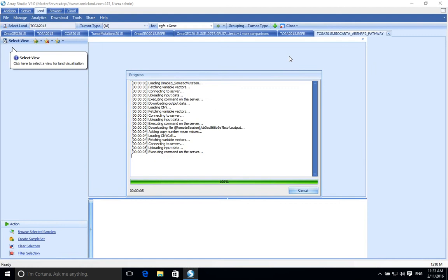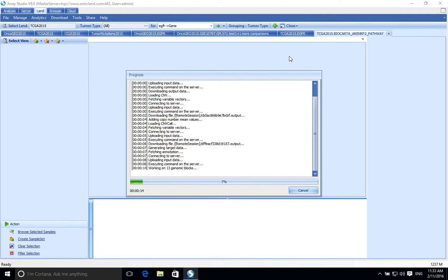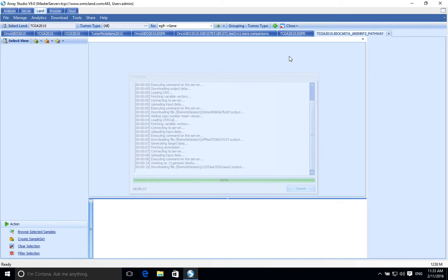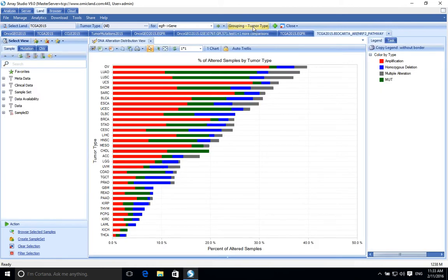And in the paper, they said that they saw more mutations in this pathway in the type 2 classified samples than they did the type 1. So we're just going to check to see if that's true, and then see if there's any new samples that you might be able to classify based on that.